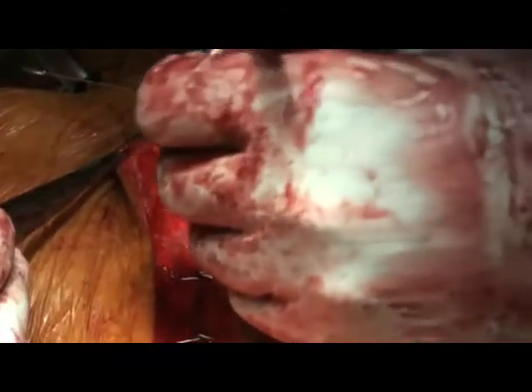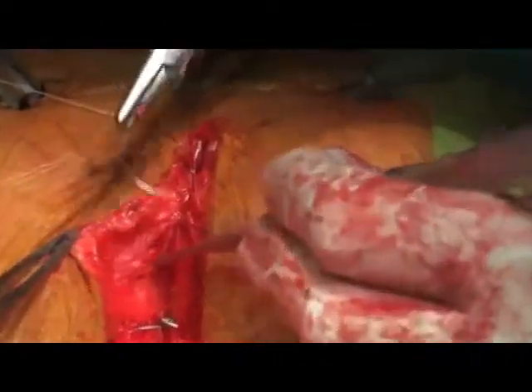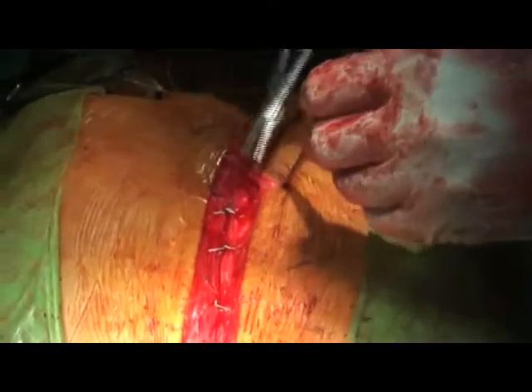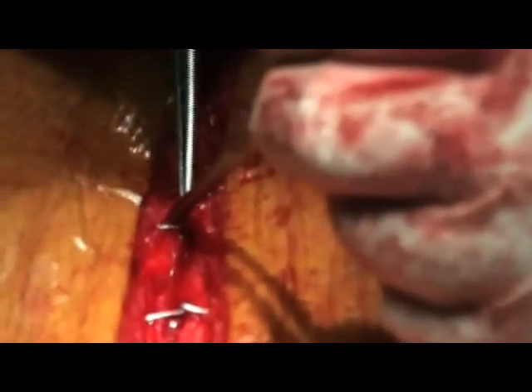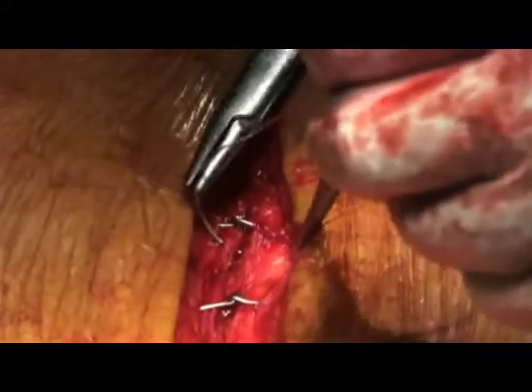I normally take only the periosteum in the first layer and try to cover the wires as much as possible with the periosteal layer suturing. Once the periosteum is over the wire, new bone will be laid down by the periosteum and the wire will go further into the bone, unable to jut out through the thin subcutaneous tissue and skin over the sternum. The second layer would be subcutaneous tissue over the periosteal layer, and the final layer would be subcuticular skin closure, which should be done neatly.